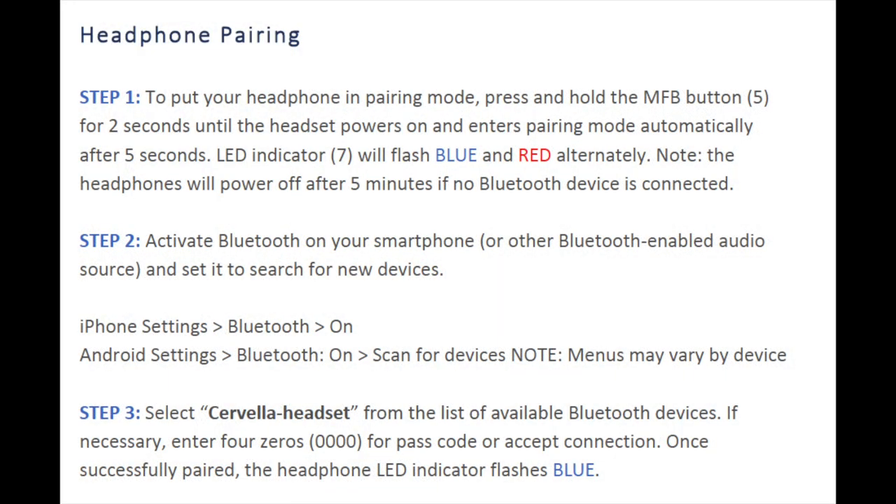If planning to use the audio feature of your Cervella headset, pair the headphones with your smart device as described in the headphones section of the owner's manual. This will enable you to use the stereo headset for listening to audio from the paired Bluetooth source or to make phone calls if paired with your cell phone.